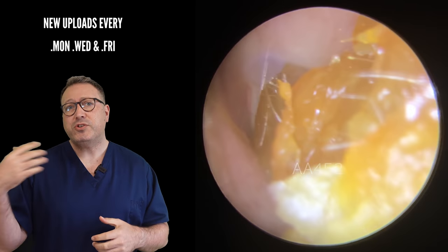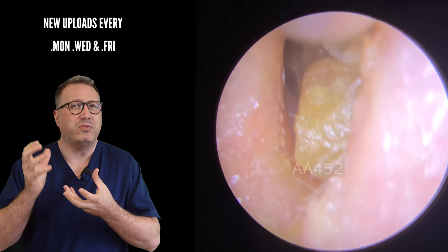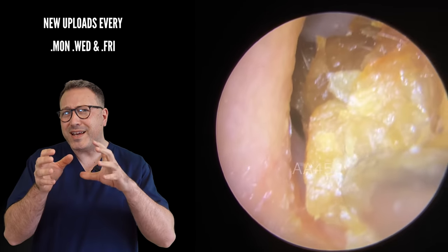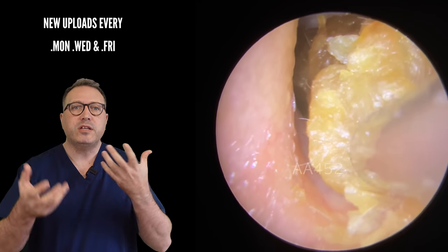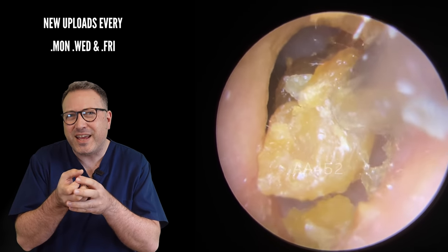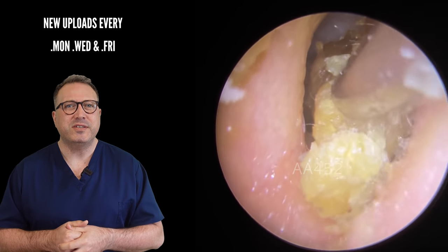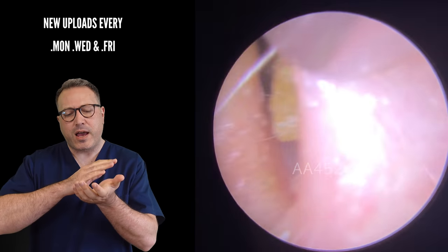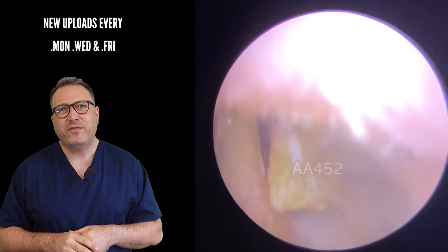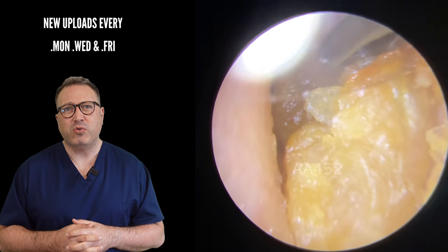This is the second patient in the compilation — a very similar story to the first one. Not really experiencing any hearing issues as such, but more of an irritation and a feeling that something's moving in the ear canal all the time. We've got the standard size Zoellner tube on here. When wax gets this much lighter color, in my experience it tends to be harder wax, usually because there are lots of little skin flakes and keratin in there, giving it a lighter appearance and making it quite tough. You can see these flakes and layers of wax and dry skin coming away.